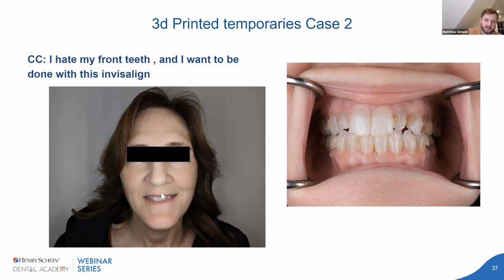Obviously there's deviation of the midline. It's off to the right. She has one bicuspid missing on that side. She has two on the left side. Something without ortho, orthodontic surgery, I can't fix. Also, number 12, sorry, is a vertical root fracture, broke off, post came out, non-restorable. So that's an immediate implant that we're doing. So obviously, this is an additive case. We're not going to make 8 and 9 bigger.